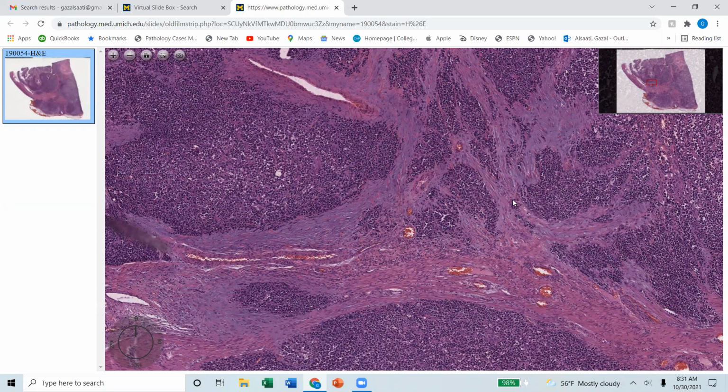So is it a neuroendocrine tumor, a neuroendocrine carcinoma, or an adeno with neuroendocrine differentiation? Lots of people had lots of opinions about it. Multiple mentors of both me and my colleagues looked at it, and they said, okay, this is a mixed tumor. We ended up sending it to Montgomery. She responded a couple of days ago that this is adenocarcinoma, and she comments that it's synaptophysin positive. So we called her back and asked, why don't you call it with neuroendocrine differentiation?